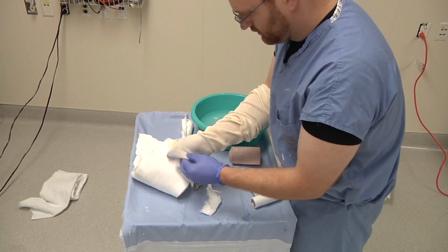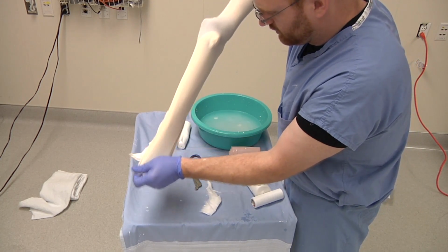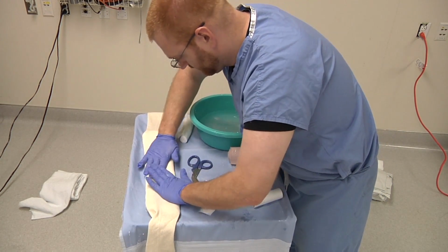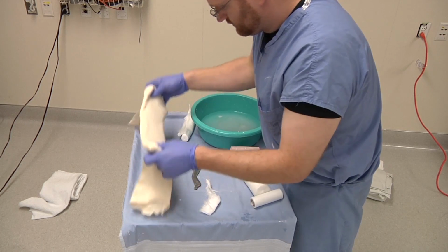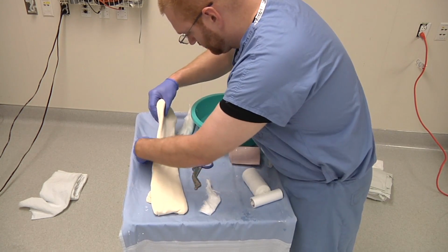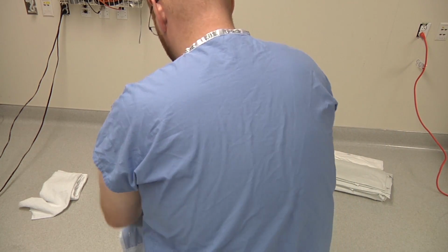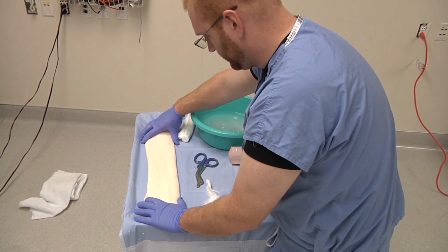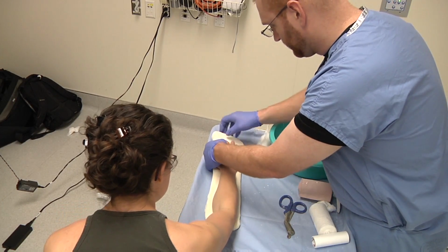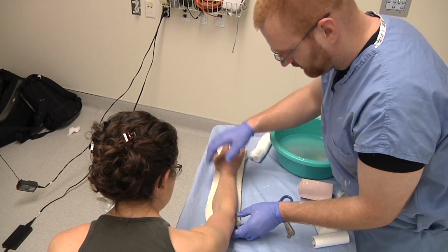stick your arm all the way through, grab it, being careful not to really roll your volar resting splint. Put it in there, flatten it out, and from there, you can apply a simple volar resting splint. From here, you just can simply mold your volar resting splint to generally a position of comfort for the patient.